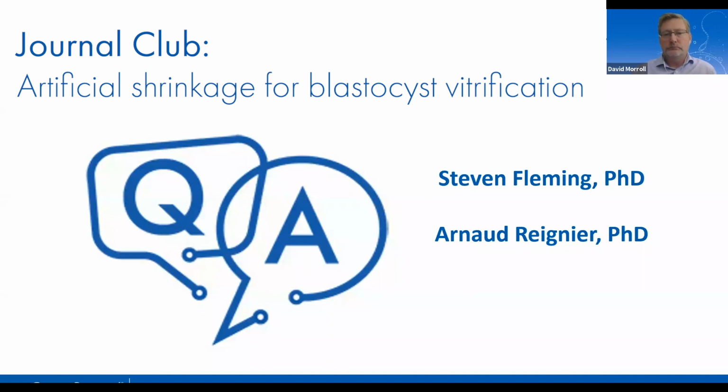Yeah. And another methodological query here. Can exposure to light be harmful during vitrification? So I think this is in addition to when you're pipetting. For all the procedures, it is recommended not to expose your embryos to too much light, but normally when you vitrify, you take your dish and put it under the light only when you have to pipette. I think it is important to keep it away from the light when you are waiting. And it is such a small amount of time that I don't think it can be bad for the embryo. And you can always use filters if you're worried.